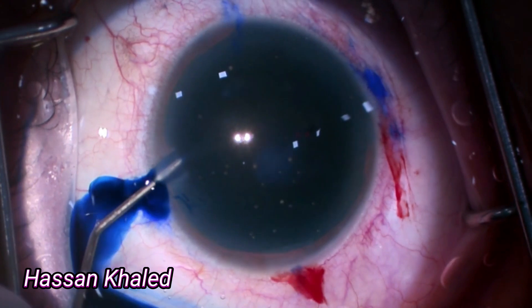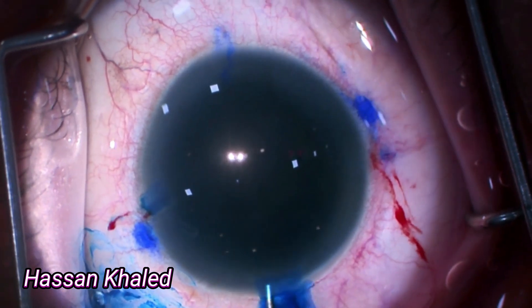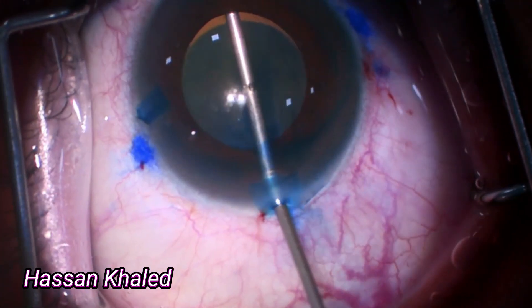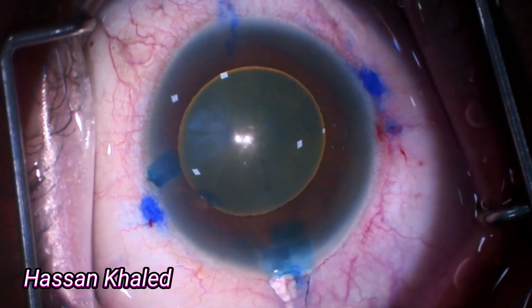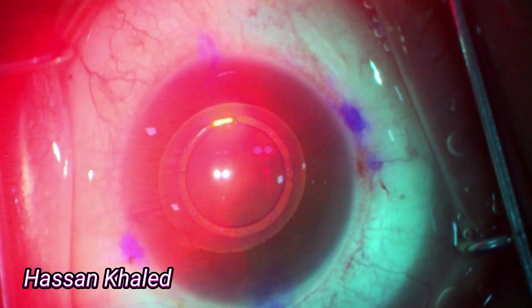After one minute, wash out the Capsule Blue. Now the TCL three-band central landmark is very clear and visible. Here is the OVD impact fill technique — injection of the OVD. The central three-band landmark is very clear and visible. Now we can see the laser circle concentric with the TCL.